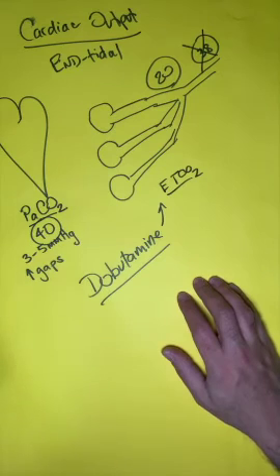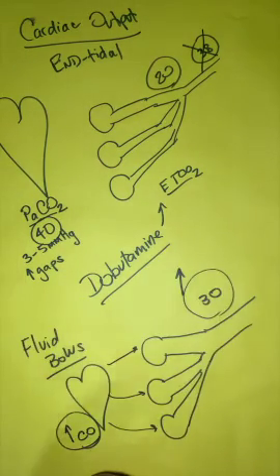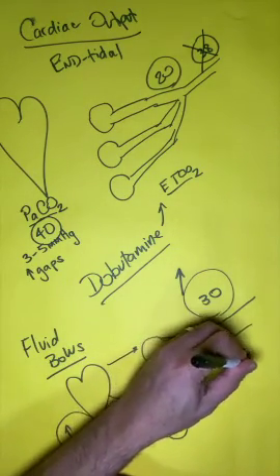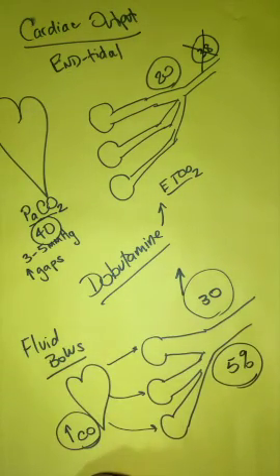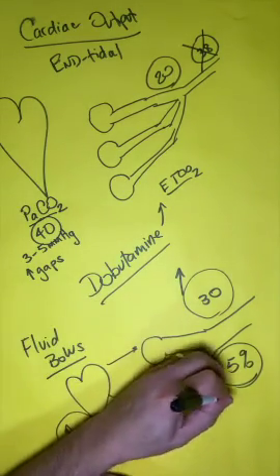At the bedside, you can look to see whether or not your patient is having an effect with the therapies that you're starting. Another way you can use this is to determine a fluid bolus. This has been looked at in small studies, and it has been shown that an increase of 5% of your end-tidal CO2 in response to a fluid bolus or a passive leg raise is consistent with a positive fluid response.